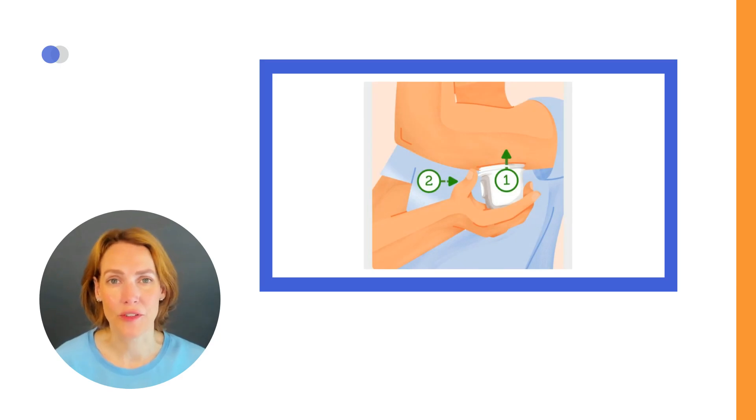When placing the sensor, do not forget to press the applicator firmly against the skin until the clear safety guard is pushed in. Otherwise, it will not be possible to press the white button on the applicator.